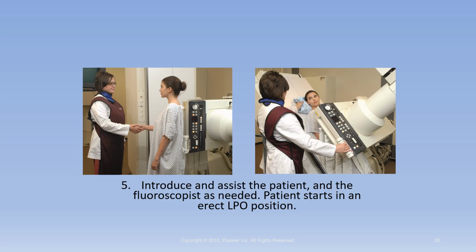We also should introduce the patient to the radiologist when they come into the room. Sometimes the radiologist will introduce themselves, which is fine. And notice in the book that they don't always say the radiologist. Sometimes they'll call them the fluoroscopist. The reason for that is because whoever's performing the fluoroscopy, that's who they're referencing. So it might very well be a radiologist, but it also could be a radiologist assistant.